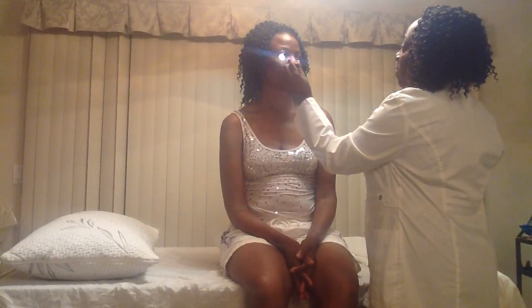So I'm going to do direct, and this is consensual. Do the other side, we're going to do direct light, and we're going to do consensual. All right, so the next test we're going to do is what we call the cover and uncover test. I'm going to ask you to put one hand over your eye, cover your right eye. I'm going to ask you to just focus on the tip of this light. Okay, uncover. Do the same for the other eye. Focus on the tip of the light. Okay, uncover.